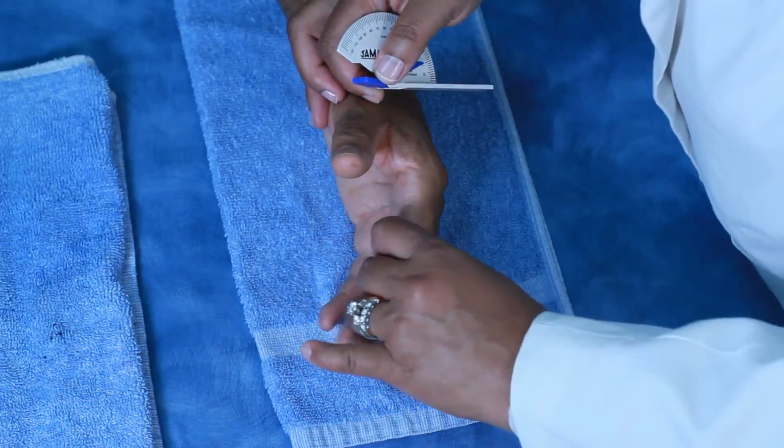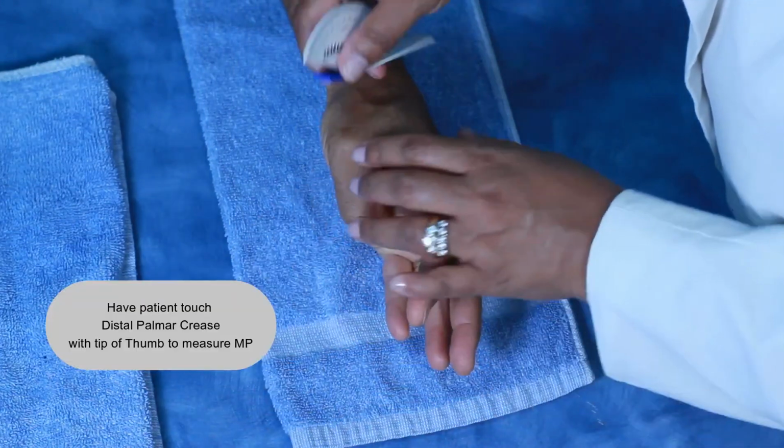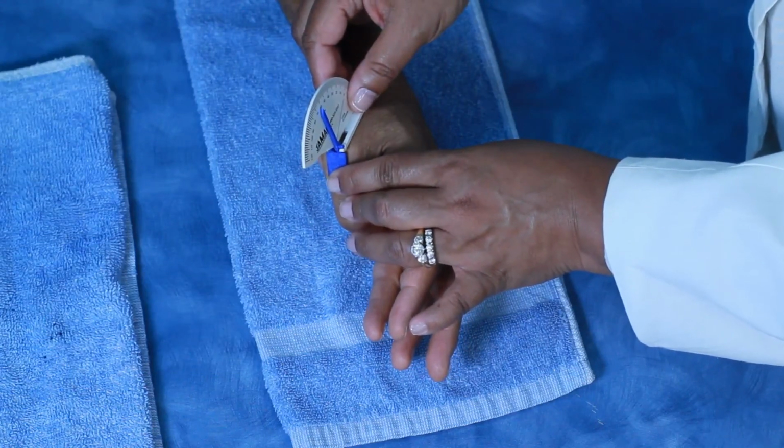Now I'm going to ask the patient to turn his hand this way, and I'm going to ask him to take the tip of his thumb and touch the distal palmar crease. So bring your thumb down like this. And then I measure here, and he has 60 degrees. That's at the MP, so 0 to 60.